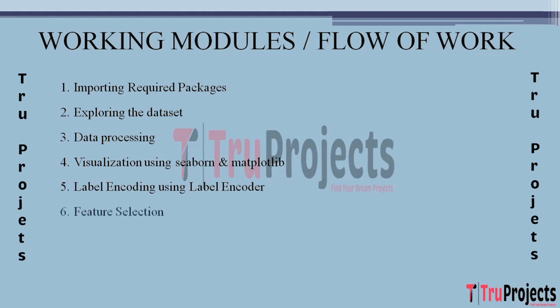The next step is feature selection. Here we identify and select features that contribute significantly to the model's predictive performance. This involves analyzing the importance of different features in predicting the target variable, optimizing the dataset for model training.